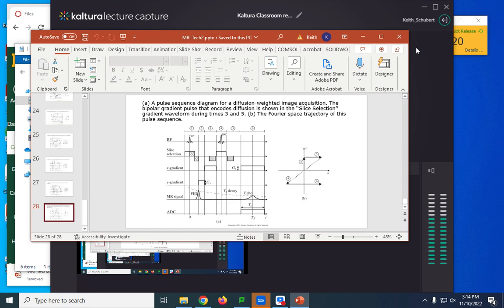Try to avoid large belt buckles, things of that sort, otherwise you're taking them off. You're going to be taking your wallet and stuff out anyway. The space is small. He may or may not want you to do that, but I would strongly suggest you do it. I think you probably will, but just count on it.